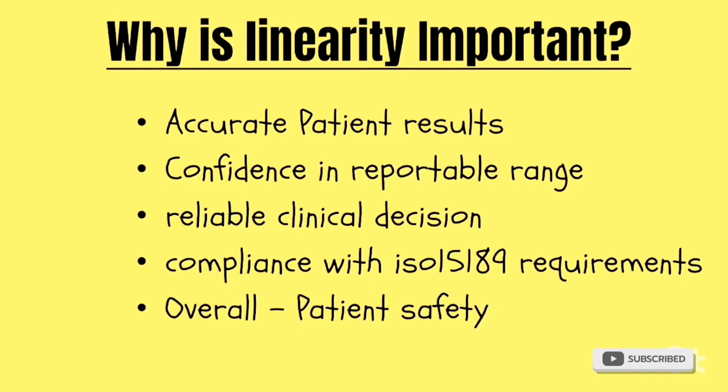You then have to dilute it. Now, maybe I should say this: that you dilute the result does not mean you are not going to give an accurate result. It helps you to work out the actual concentration. Maybe I should give you an example. If you do a 1-in-2 dilution, okay, the analyzer will calculate it for you anyway, but let's say in manual terms, if you do a 1-in-2 dilution, then when you get a result, you have to multiply it, basically. Okay, all right.